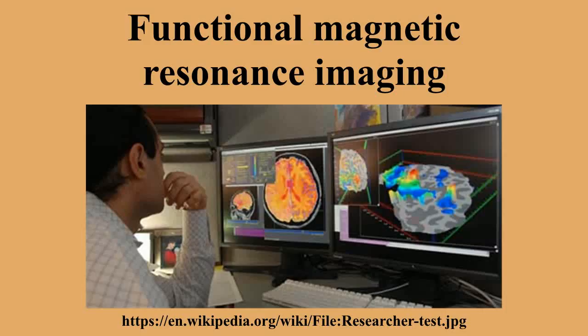The first attempt to detect regional brain activity using MRI was performed by Belliveau and others at Harvard University using the contrast agent Magnevist, a paramagnetic substance remaining in the bloodstream after intravenous injection. However, this method is not popular in human fMRI because any medically unnecessary injection is to a degree unsafe and uncomfortable, and because the agent stays in the blood only for a short time.